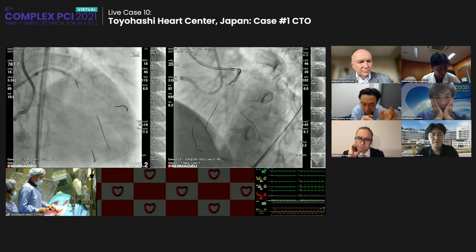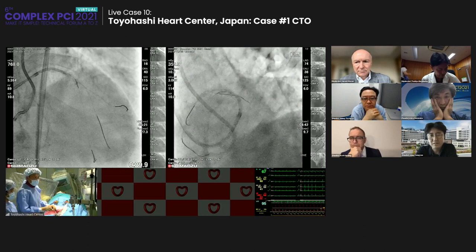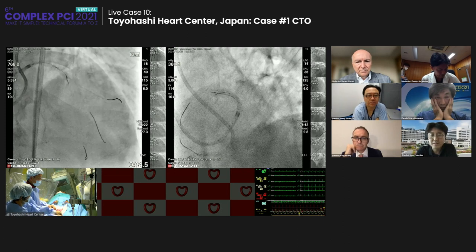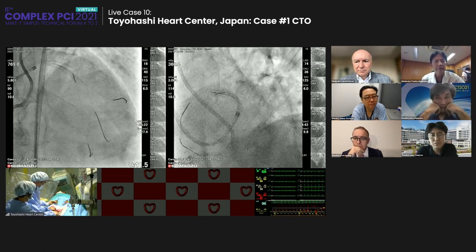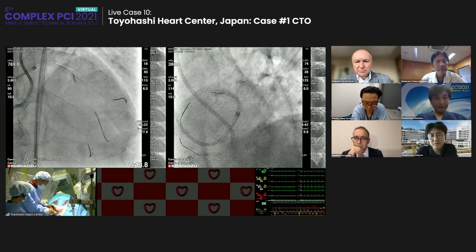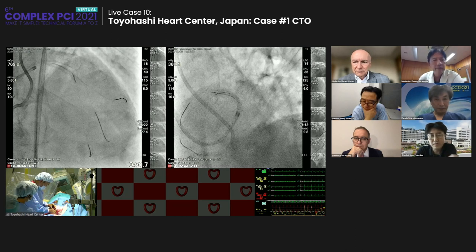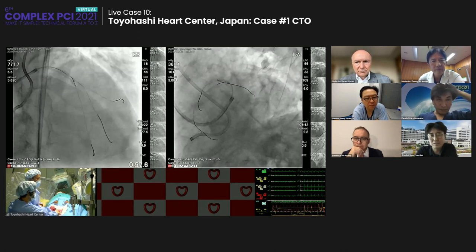Yes, thank you, that's a very nice question. So in the de novo region, for vessels larger than 3.0 after drug-coated balloon, if there is some dissection or some heavy plaque burden, we measure the FFR. But for less than 3.0, usually, regardless of the imaging information, I just put the drug-coated balloon, because a very small lumen can make possible a larger lumen gain in the future.